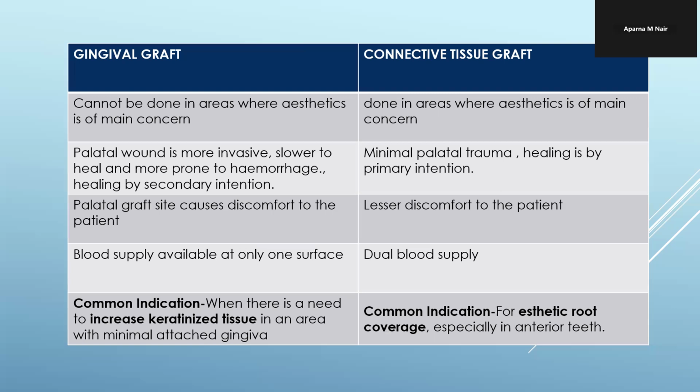While in the connective tissue graft technique, we are reflecting a partial thickness flap, after that we harvest the connective tissue, replace the flap back into position and suture it. So there is only minimal palatal trauma and healing is by primary intention.